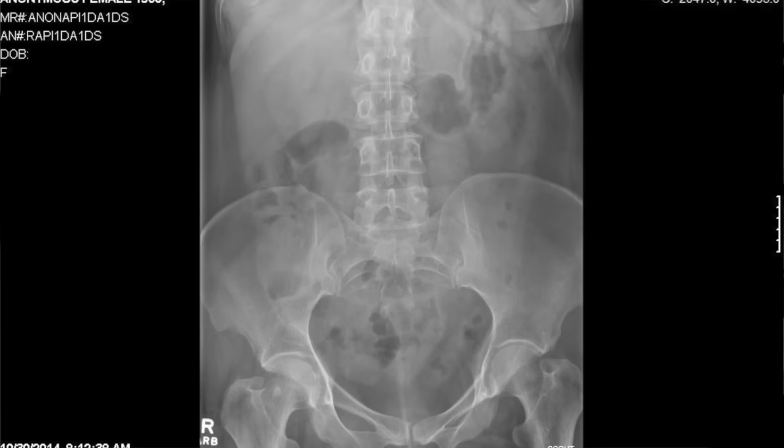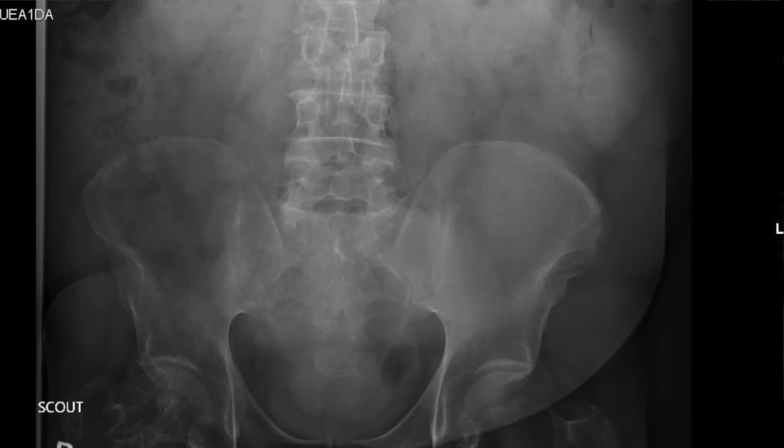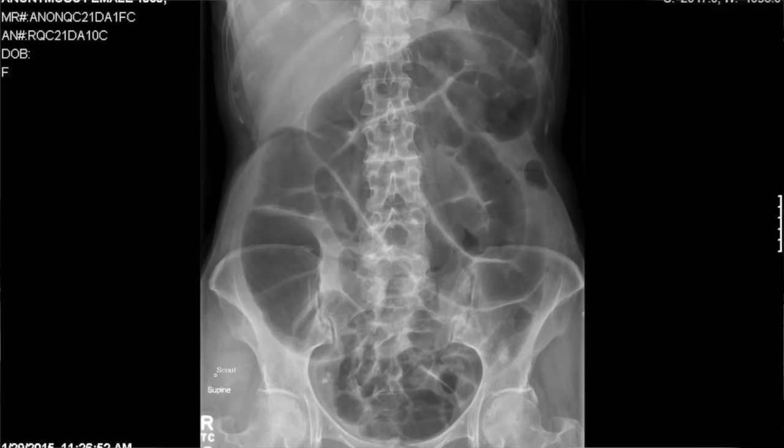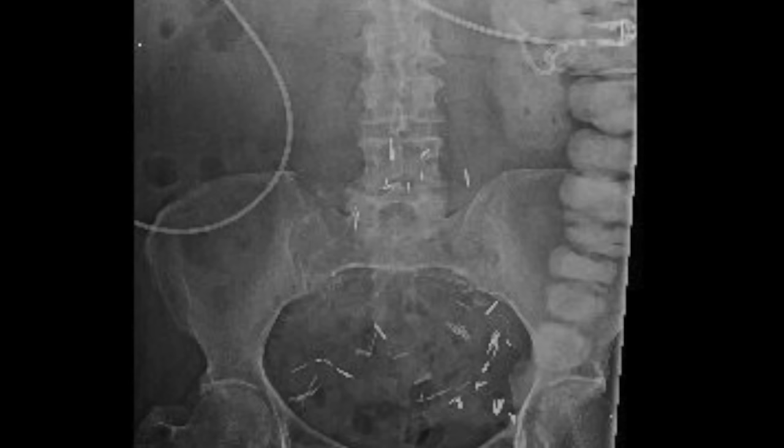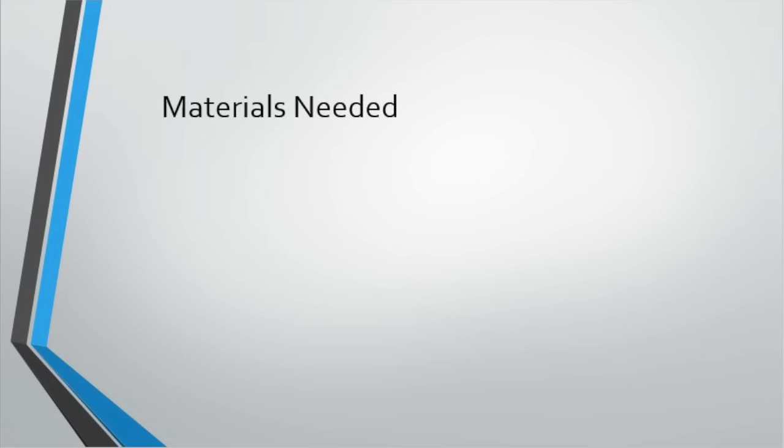A preliminary scout radiograph can be helpful in cases post-GI surgery or with a clinical history suggesting obstruction, perforation, inflammatory bowel disease, fistula, or abscess. It can also be helpful if there are suspicions of an ineffective colon prep. In this scout, radiopaque surgical clips are seen, as well as residual contrast from a prior CT examination, which caused the exam to be delayed.